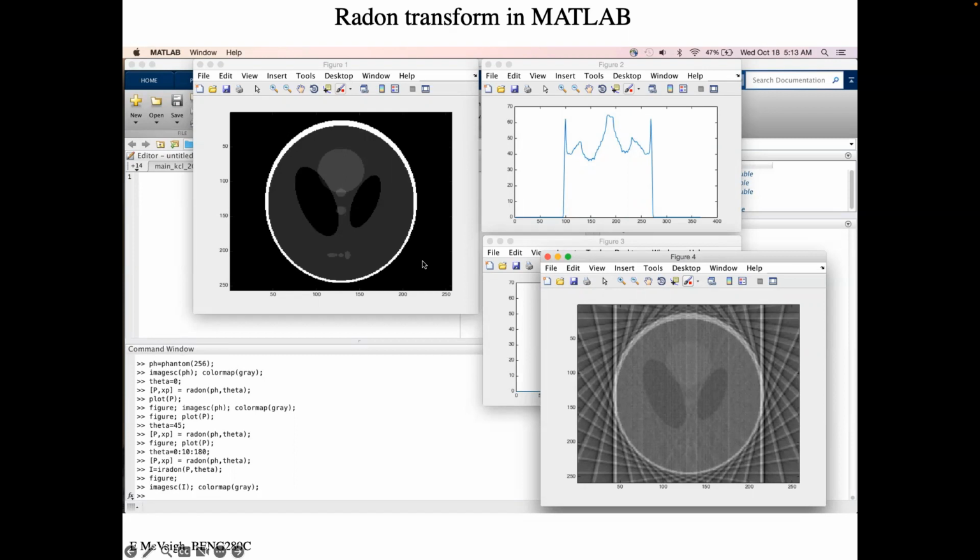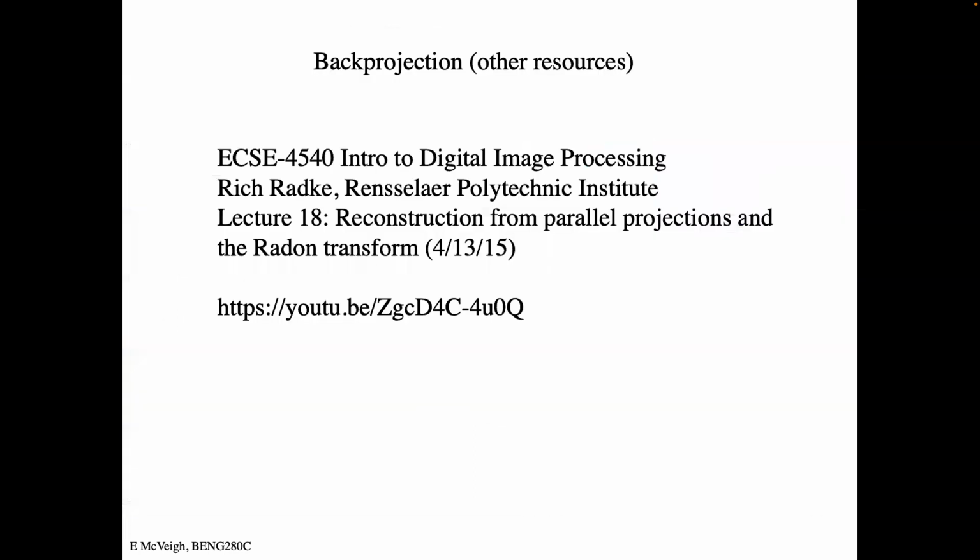Then you can do things like, what happens if I use half of that data to reconstruct a CT picture, by cutting half of it off, so I sample for half the time, and you see what the resulting image is. Or I could sample every other view or every fourth view and see what the picture looks like under those conditions. So you can just get to know the radon transformation.